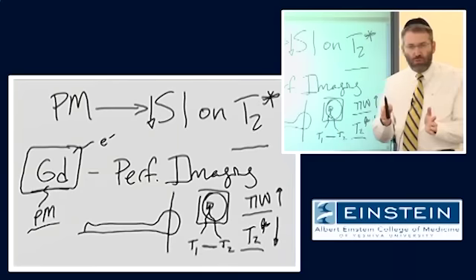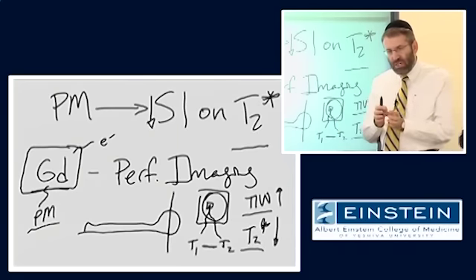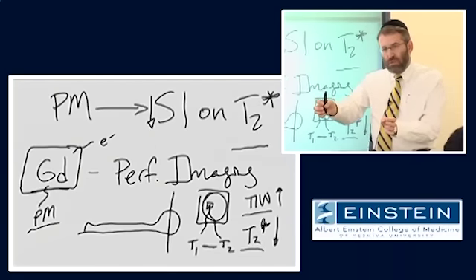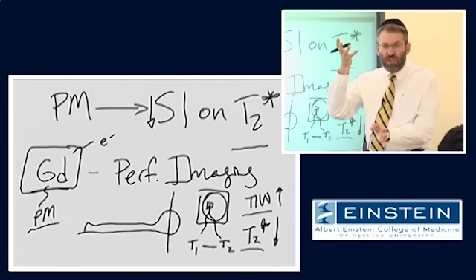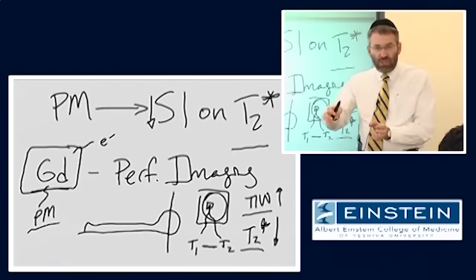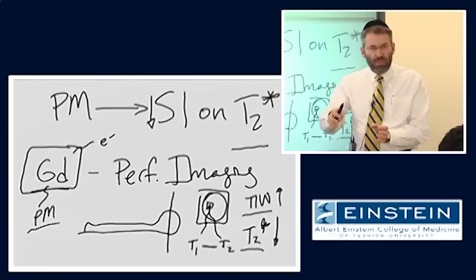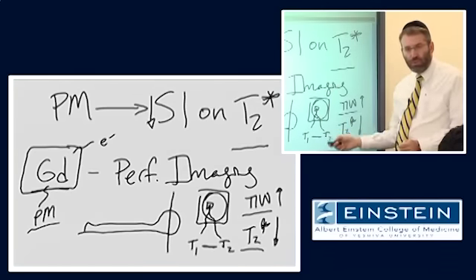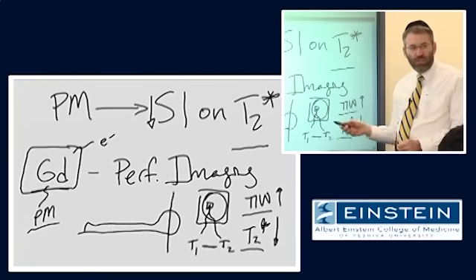If there's a ratio between how much of the contrast agent gets to one part of the tissue and how much gets to another part of the tissue, the larger the volume of contrast we deliver, the greater the absolute difference in concentration of the contrast at those two locations. Essentially, this change in signal is proportional to the local concentration of the contrast agent.